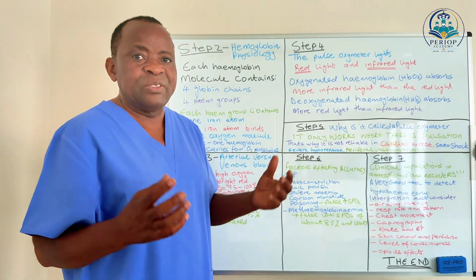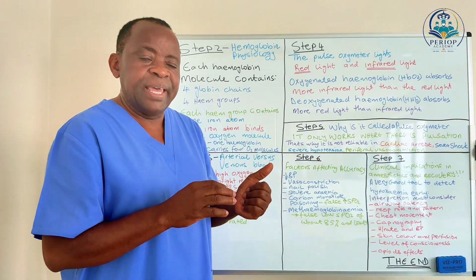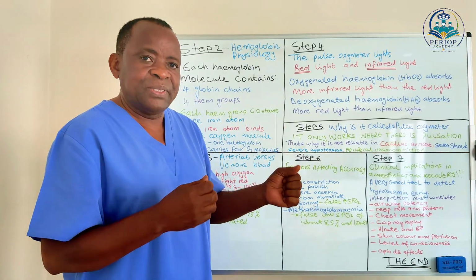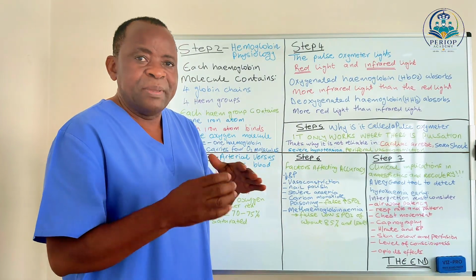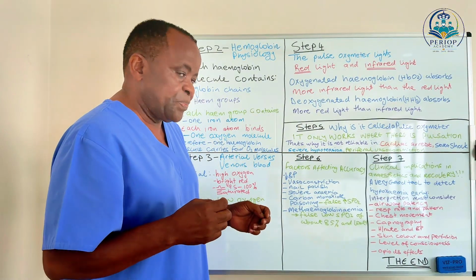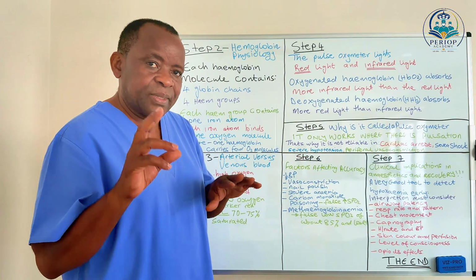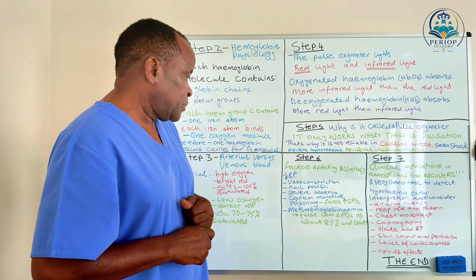Therefore, patients who come into theatre would be required to take off the artificial nails and scrape off the nail varnish, maybe 2 or 3 fingers, to have access to a better perfused part of the body, in this case the finger.